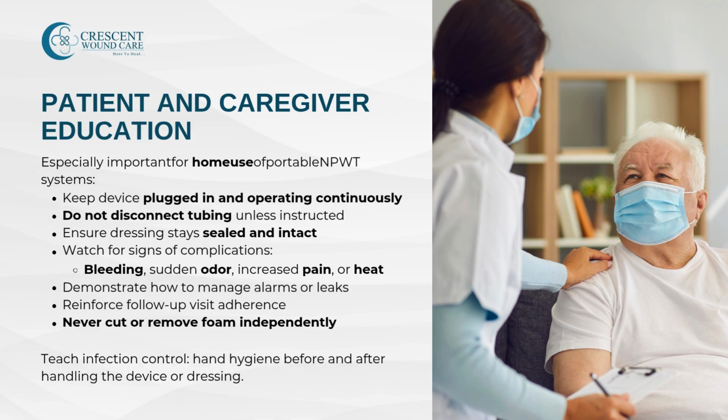Proper education empowers patients and caregivers, particularly when NPWT continues outside of the hospital. Here are the core teaching points. Keep the device powered on and connected at all times. The system needs constant suction to function correctly. Avoid disconnecting or tampering with the tubing unless instructed by a clinician. Disruption in negative pressure can delay healing.